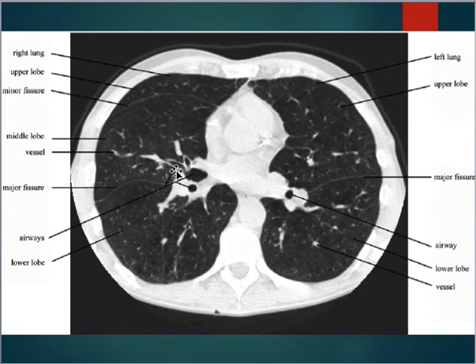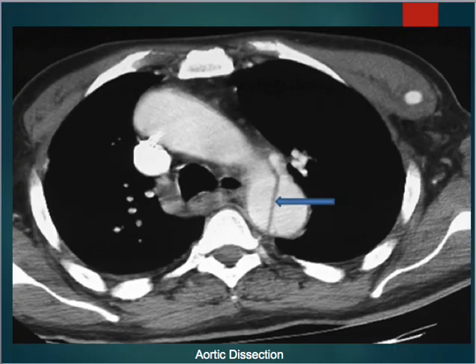Again, another chest CT. Black is all of the air. You can see all the little bronchioles and vessels all throughout here, all these little white things. You've got, again, the spine here. And then another chest CT. In this one you can see more black. You can't see the vessels as much on this one. So this is just straight air. Make sure you know, when you're looking at a chest image, in case you're asked what a chest CT looks like, that you would be able to differentiate between the abdomens that I'll show you later that are filled with organs versus the air in the lungs that's all black.